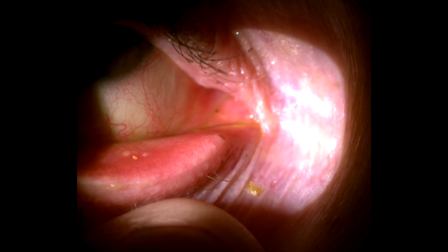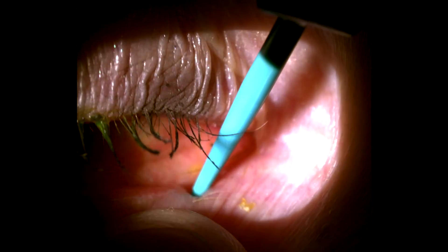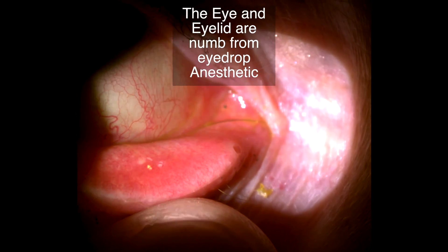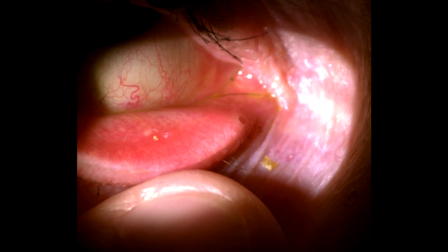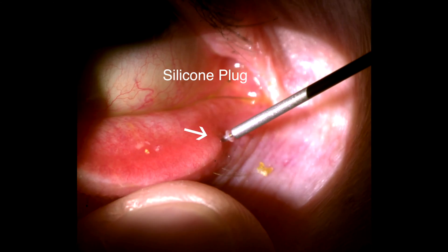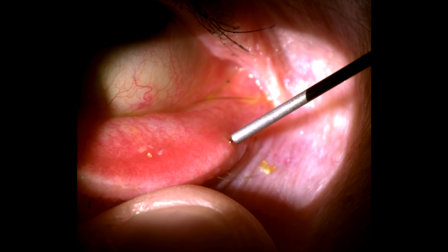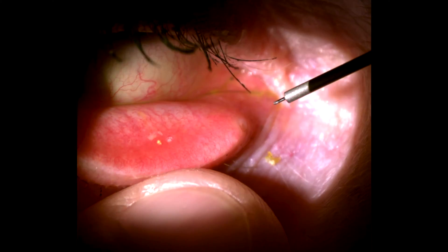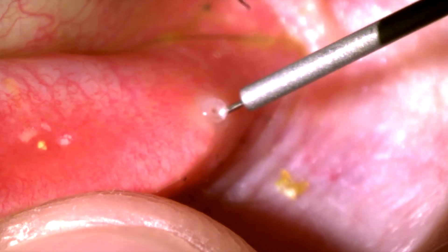A common treatment for dry eye involves placement of a small silicone plug to block one of the two tear ducts that allow tears manufactured on the ocular surface to drain from the eye into the nose. A silicone plug can be inserted quickly and painlessly with eyedrop anesthetic. The procedure takes seconds to perform, and patients can experience significant improvement in their dry eye symptoms within days.